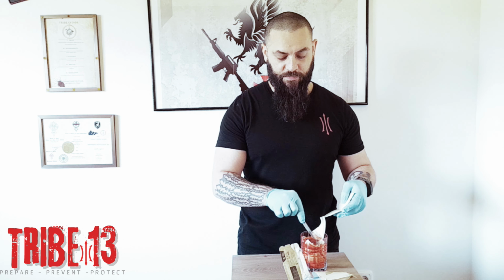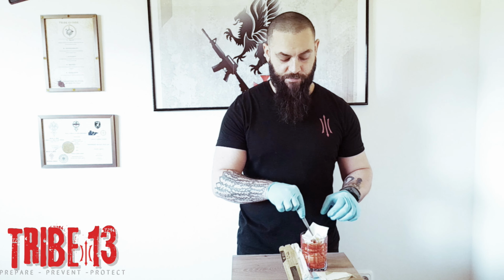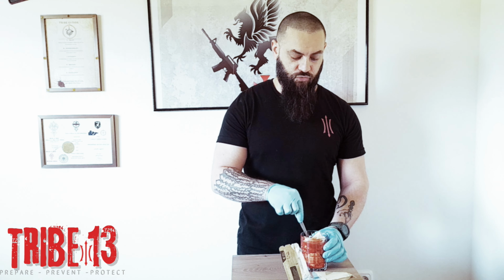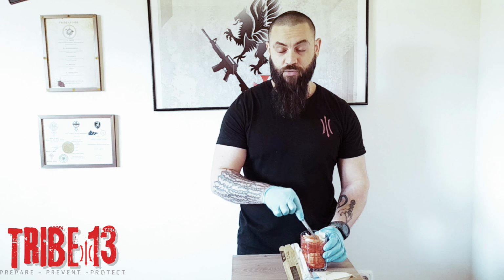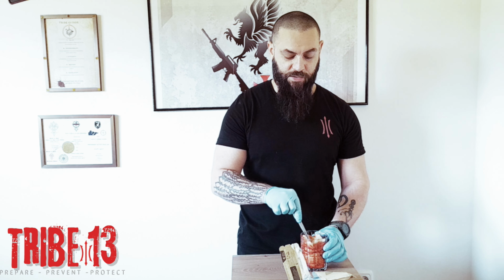The idea is that if you are not in a danger zone, in a danger area, then it's advisable to maintain pressure on the wound until the professional medical care is arriving.